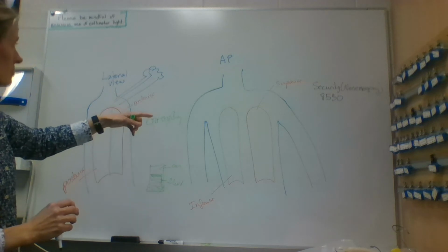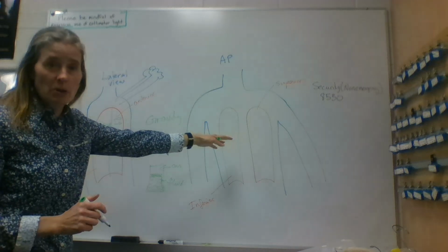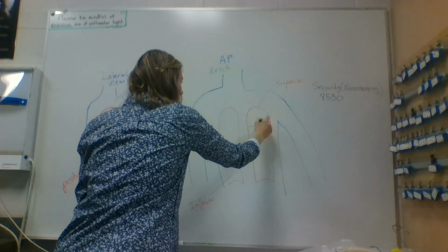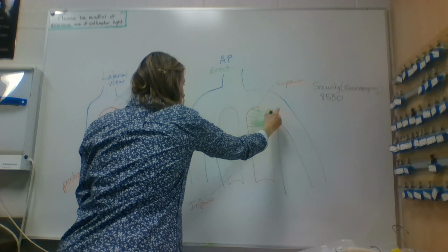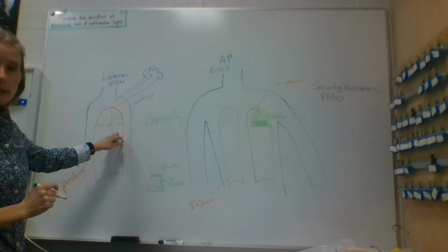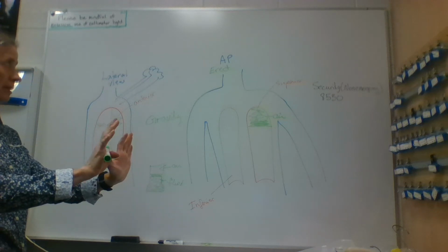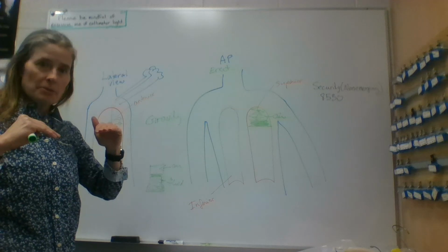We also want the chest tube inserted, if it's a pneumothorax, into the superior part of the chest, so that when the patient is erect or upright, the superior part of the chest is where the air is. So this is air. They're lying down supine, air comes anteriorly. They're upright, erect, air rises superiorly.